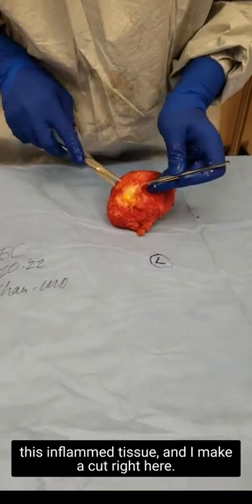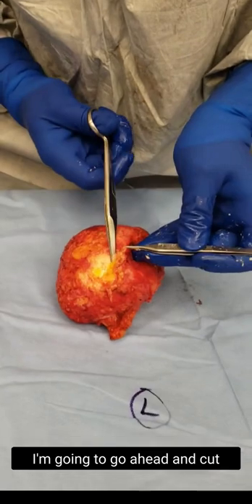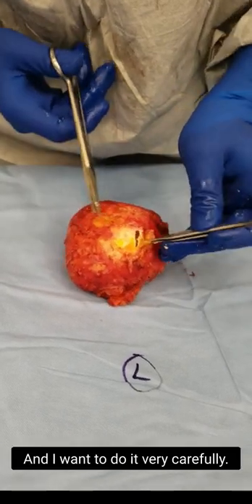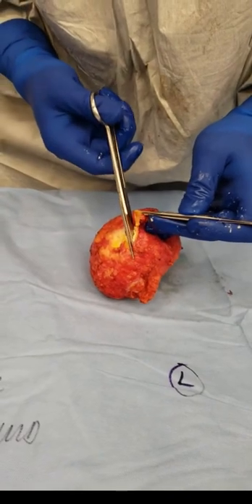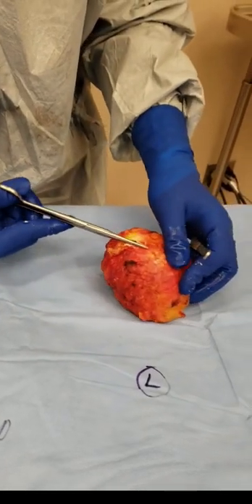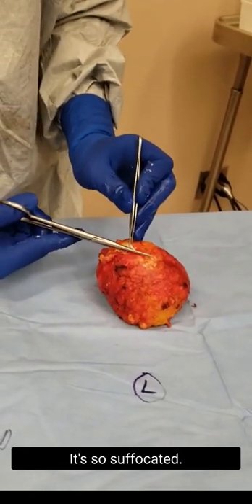As I make a cut right here you can come in and have a look. I'm going to go ahead and cut. It looks like the implant right here — I'm going to do it very carefully. It wants to just jump out; it's so suffocated.